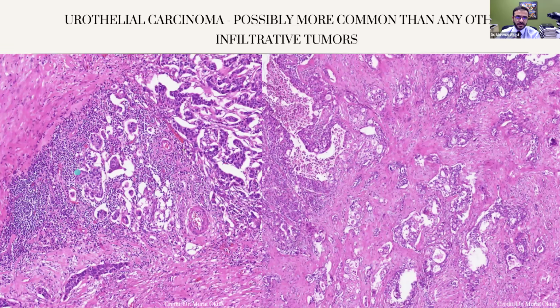Another case, probably relatively more recent than the previous case that I showed you, a renal mass biopsy in an elderly male, and again, it's a tumor with high-grade atypia. There is somewhat papillary formation. They are mostly eosinophilic and even some like jet pink cells, but the nuclear atypia is present.